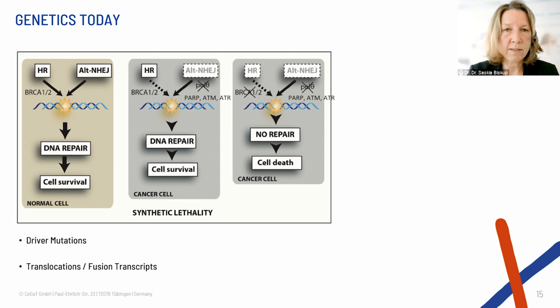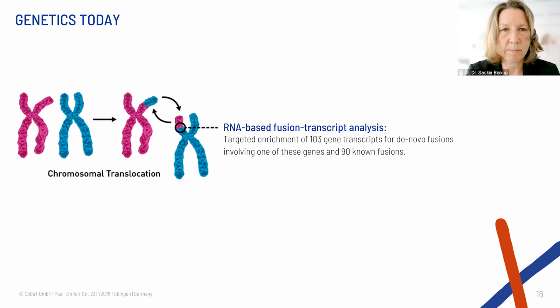With fusions, it's another story, and I think Stefan explained our fusion transcript analysis to you. Why did we spend so much time to develop this extra test? Because I told my team, I don't want to have a single patient where you overlook a fusion. And why is this so crucial? Why should you never overlook a fusion?